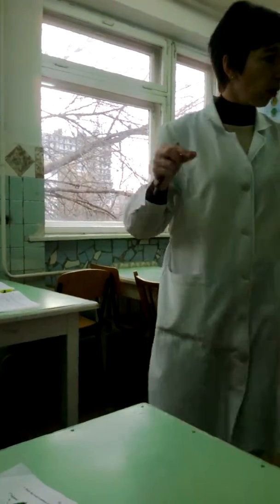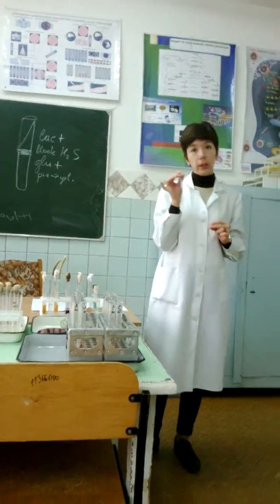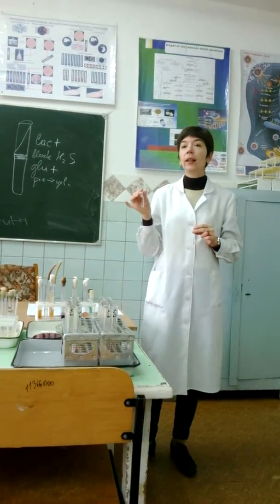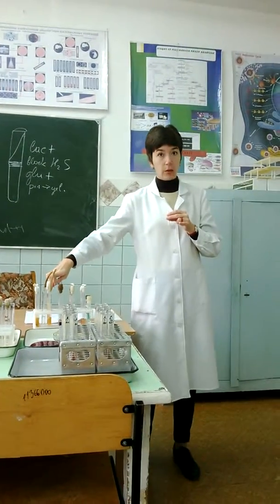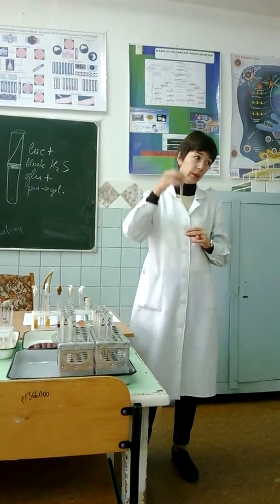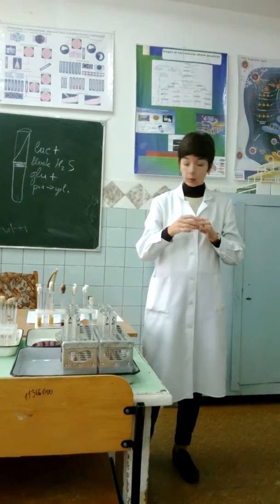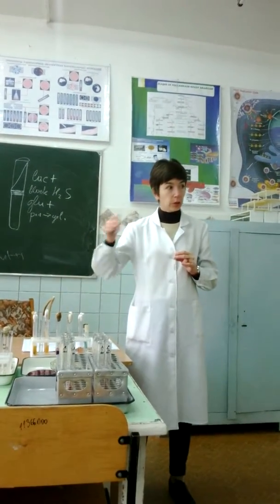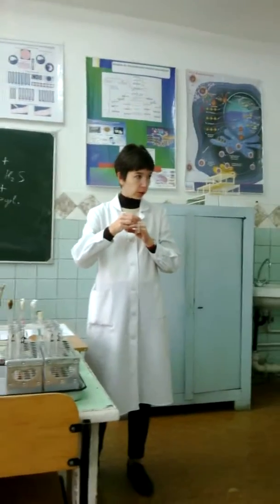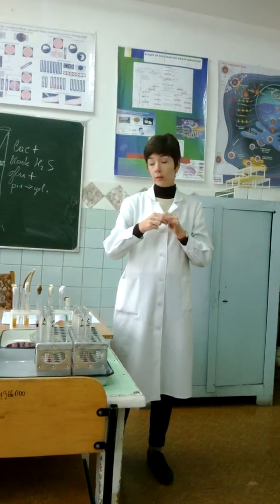There may also be other test tubes for control. How to set up controls? For control of antigens, you add normal serum. It should be present in the test tube. It's normal serum, and then on top, antigens. It's a control of antigens. For control of precipitation serum, first you add precipitation serum and next saline solution. Is it clear? Okay.